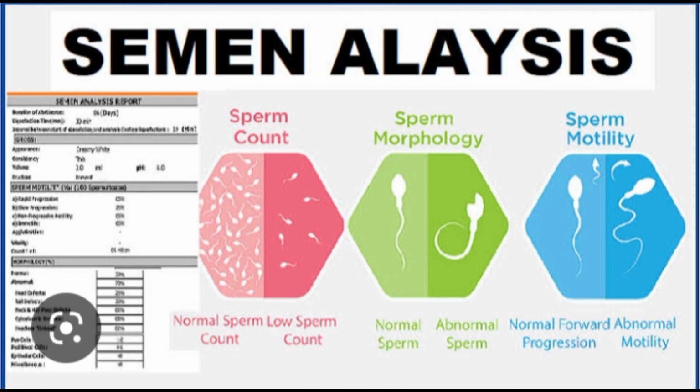Morphological examination of spermatozoa. Preparation of smear and staining. A thin smear of semen on a glass slide is dried in air and fixed by heat. Add 1% chloramine for a few minutes and remove excess mucus. Wash by blotting on filter paper. Stain for 3 to 5 minutes with Ziehl-Neelsen carbol fuchsin.